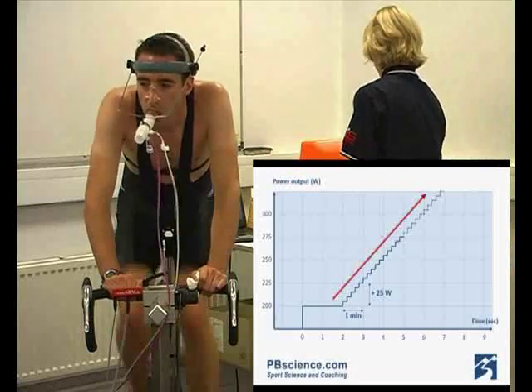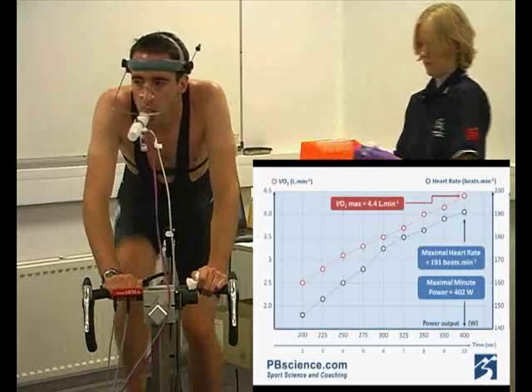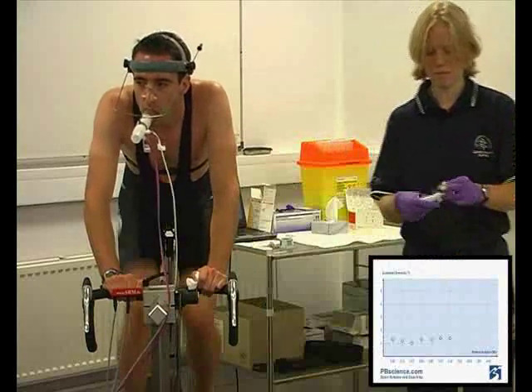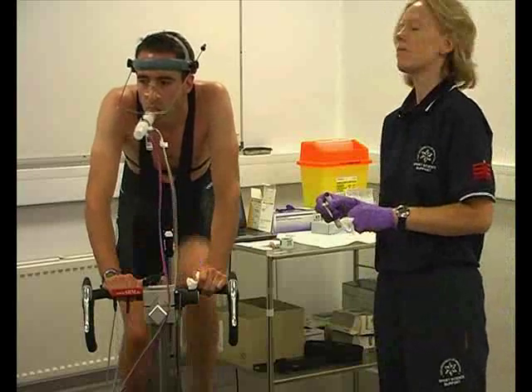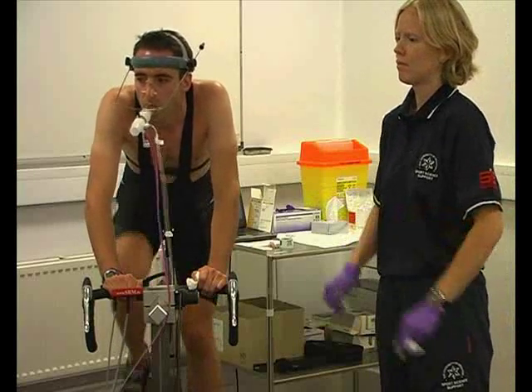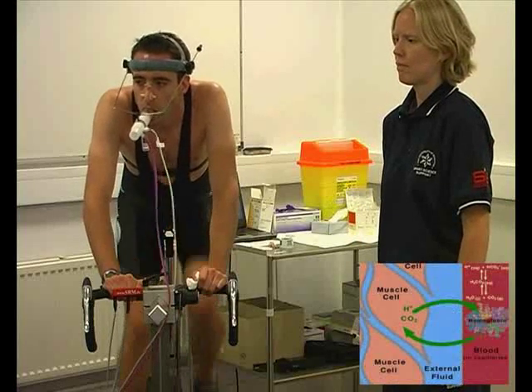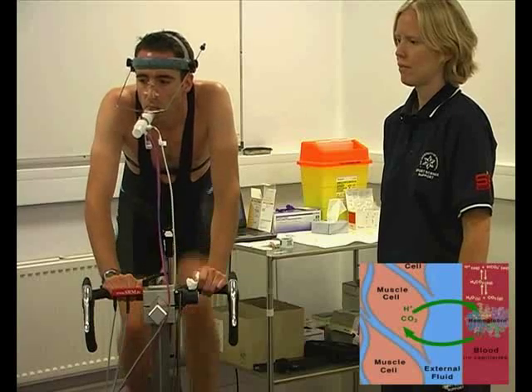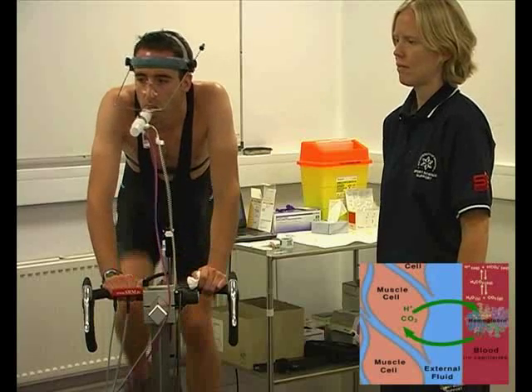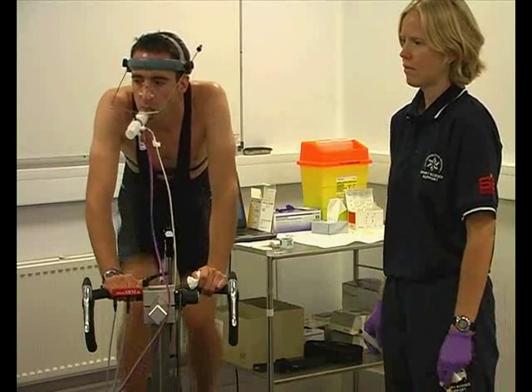As you can see in this graph so far, we've got steady blood lactate concentrations. He's yet to go past his lactate threshold. When blood lactate values are steady like this, it means the rate of lactic acid production in the muscles is being balanced by the blood lactate clearance in the blood. In other words, our athlete's in a nice comfortable steady state.